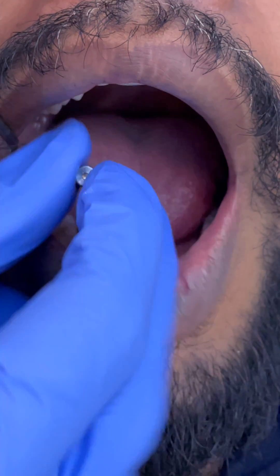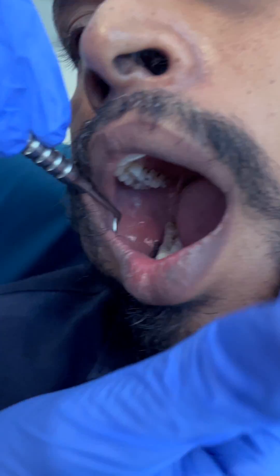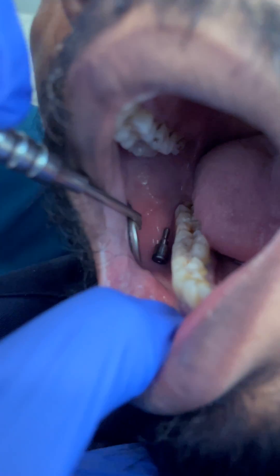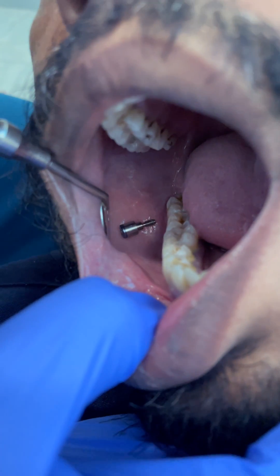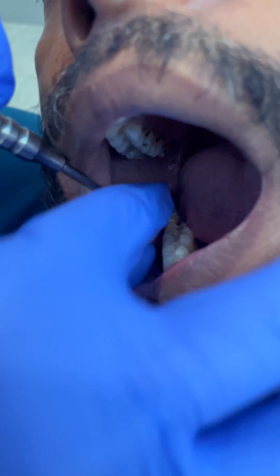Here's a very simple trick to avoid this problem. Imagine we have a healing abutment — you've just unscrewed it, you have it, and it slips out of your hand. Immediately turn your patient so that it settles safely in the buccal mucosa. It's impossible for them to swallow it at this point.